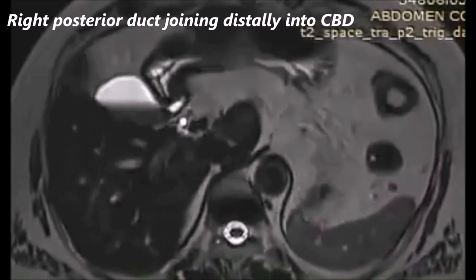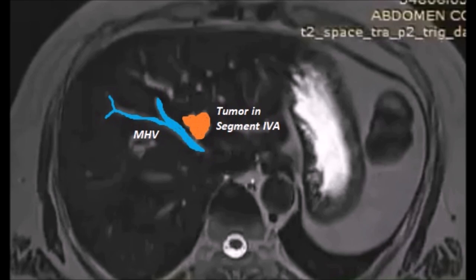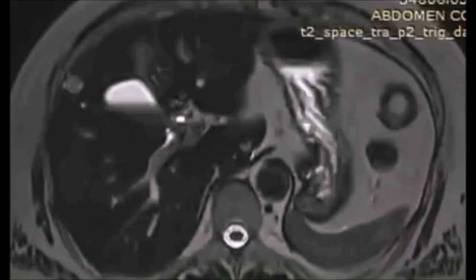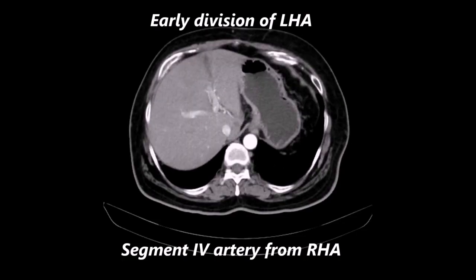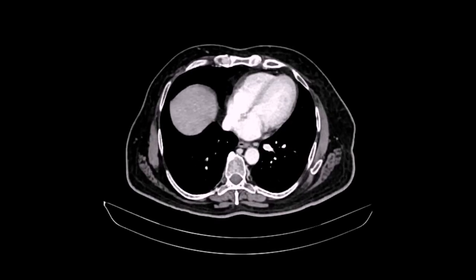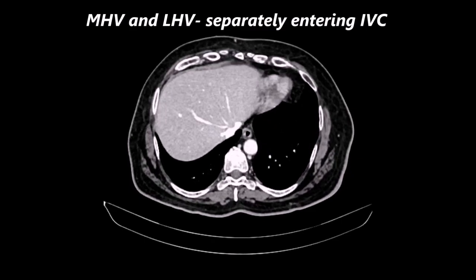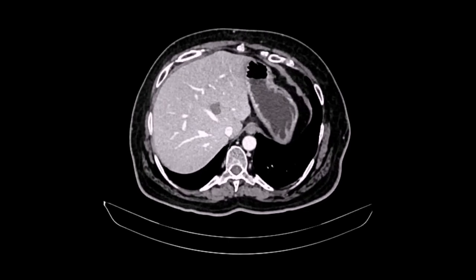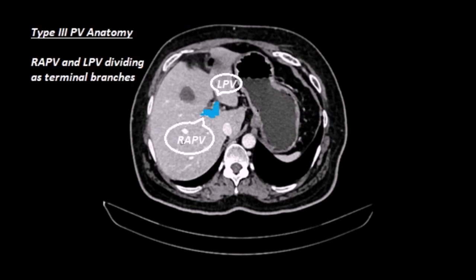We can see there is a right posterior duct joining distally into the CBD. The segment 4a tumor was close to the middle hepatic vein and was slightly posterior and cephalad to the biliary confluence. The patient had a left hepatic artery coming from the right hepatic artery, and the middle hepatic artery from the right hepatic artery also. The middle hepatic vein and left hepatic vein were entering separately into the IVC. Segment 4a was close to the MHV, with type 3 portal vein anatomy concordant with type 3 biliary anatomy.